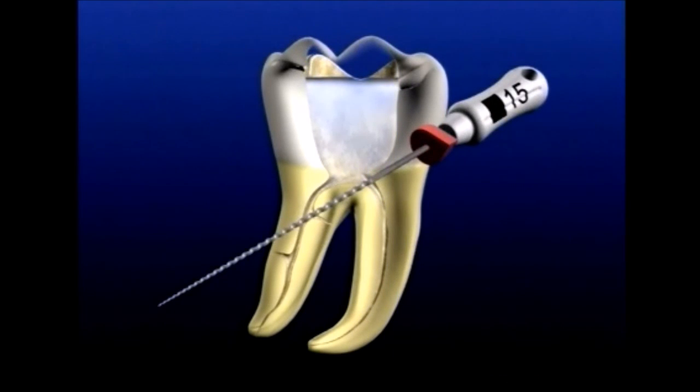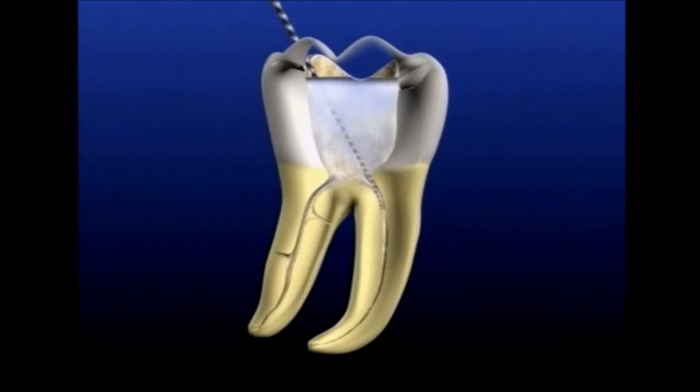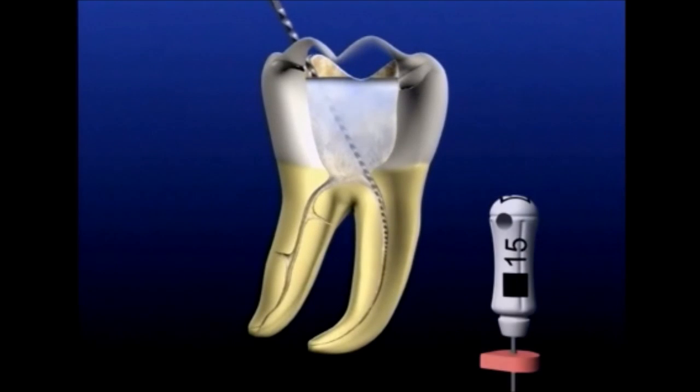The next instrument in the series is the 15 file. Recall it's a 15 at D0 and a 47 at D16. This implies that this instrument can create more space than its numerical name would suggest. Feed it in until the handle is just snug, and when we pull, we're cutting importantly out of the canal, away from the terminus, and towards the greater cross-sectional diameters. Another 6 cutting cycles completes the work.